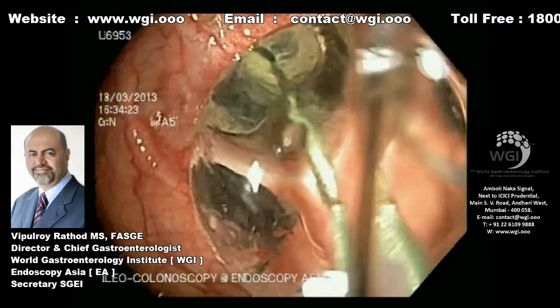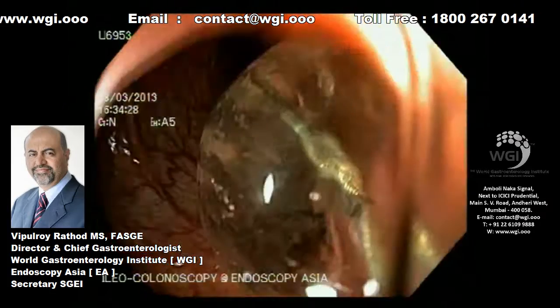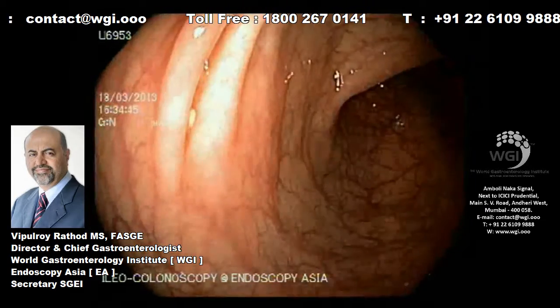We don't routinely biopsy these very benign strictures, as there is no evidence of neoplasia. After a minute of dilatation, we can quite easily pass the scope over the balloon and enter the proximal colon with ease.